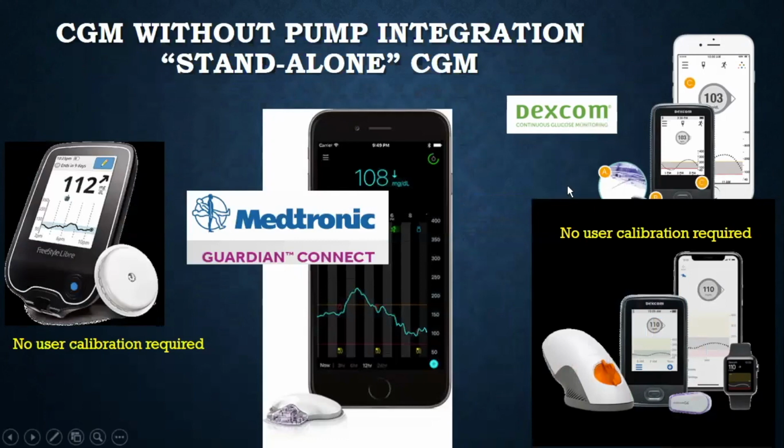Another common system is the Dexcom. Their latest model is the Dexcom G6. Again, there's no need to calibrate the sensor to make sure that it's in line with a finger stick blood glucose. It does that on its own and has been shown to be accurate by MARD.